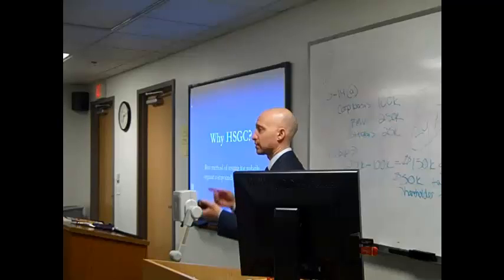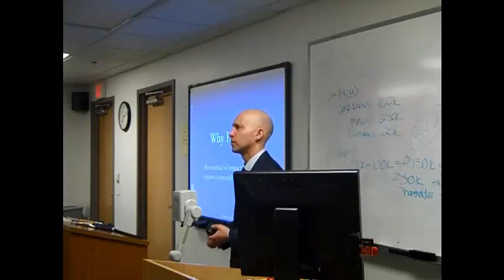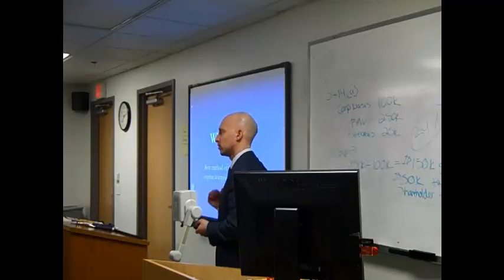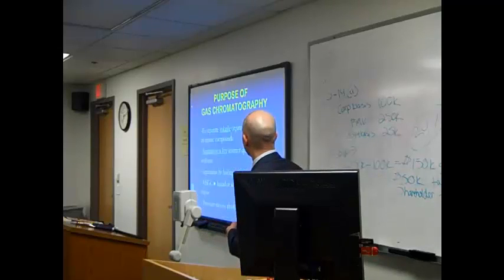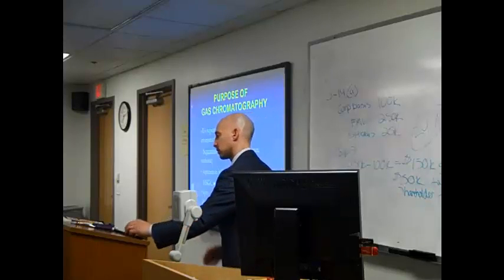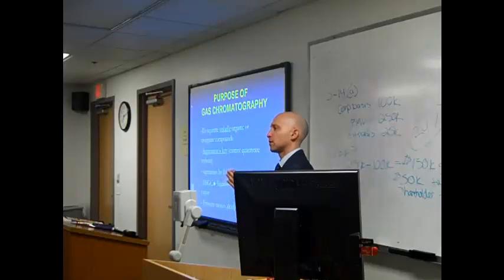Now, it can be used to test inorganic and organic compounds. I think a teacher said to me one time, if you can smell it, you can test it using gas chromatography. But headspace gas chromatography is a little bit different than just regular gas chromatography. What's the purpose of gas chromatography?